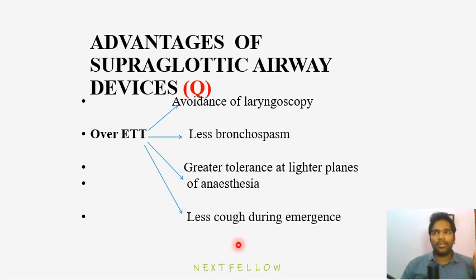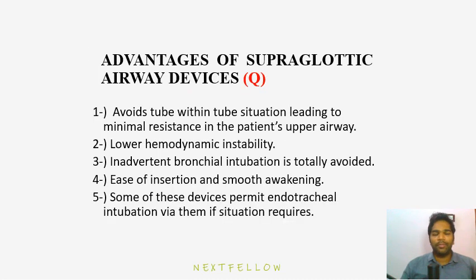Less cough during emergence. Before extubation, you might have seen patients coughing and bucking and struggling with the endotracheal tube. But with LMA, it will be very minimal. The patient will be very comfortable. Sometimes even the patient will respond to you. Sometimes they will open their eyes and you will ask them to do something, and they will respond. It will be very quiet and comfortable for the patient.